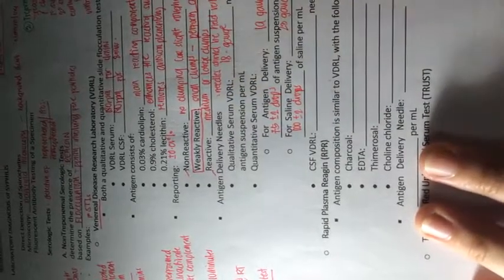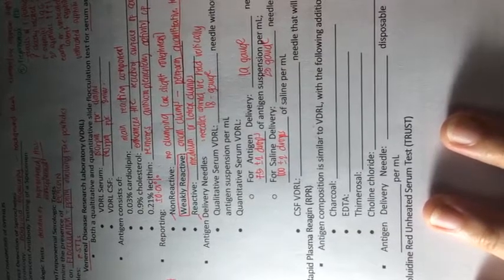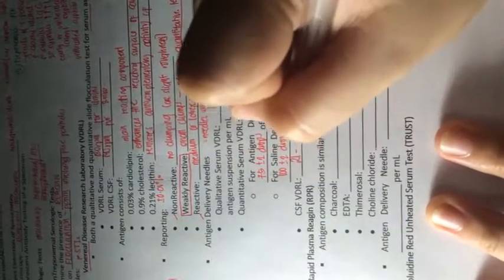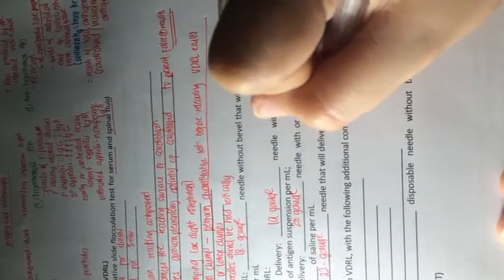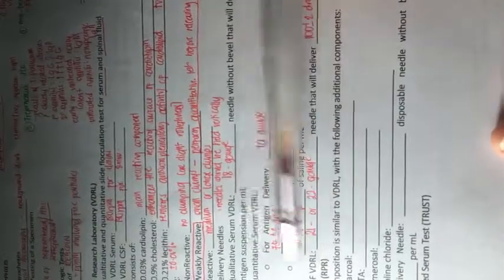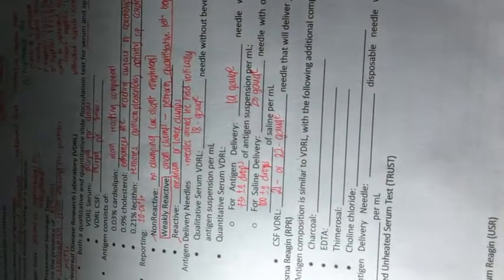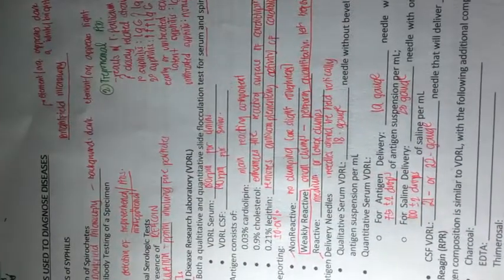As for your CSF VDRL, qualitative, we can use either a 21 or 22 gauge needle that will deliver 100 plus minus 2 drops per ml. Take note that if the sample is CSF, we should rotate it at 180 RPM for 8 minutes. Okay, so that's all for your VDRL non-treponemal serologic test. Now let's proceed to your RPR.